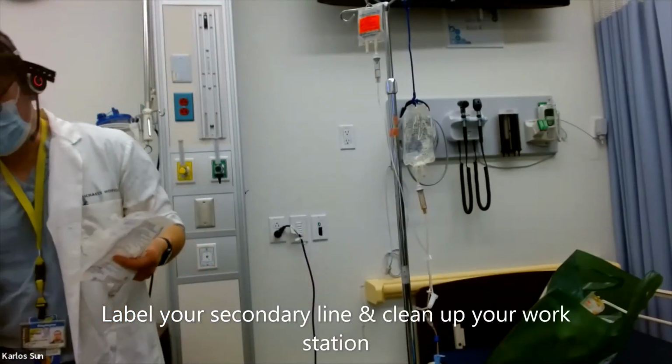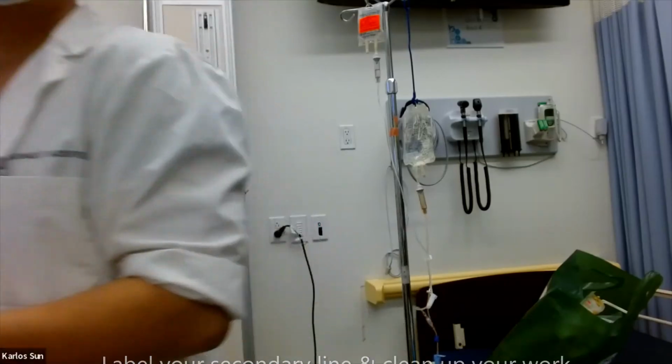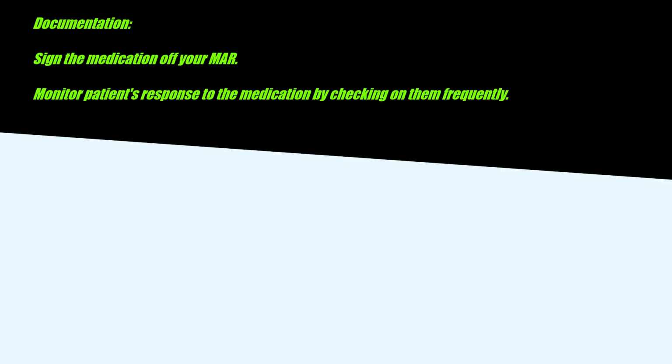Finally, label your secondary line and clean up your workstation. For your documentation, please ensure you sign the correct medication in the correct time slot in your MAR.